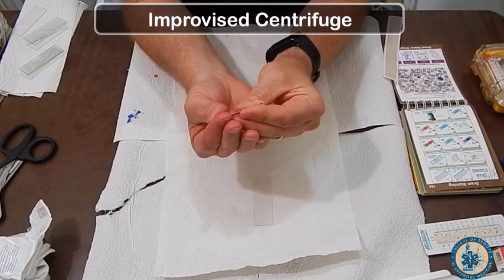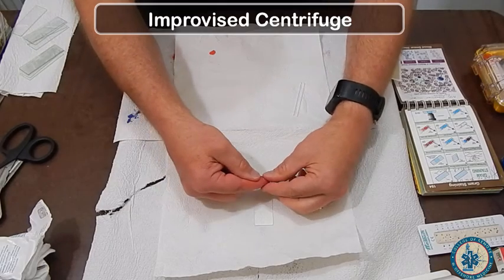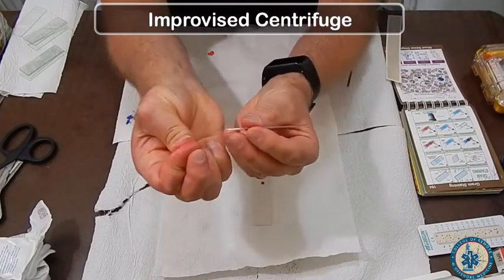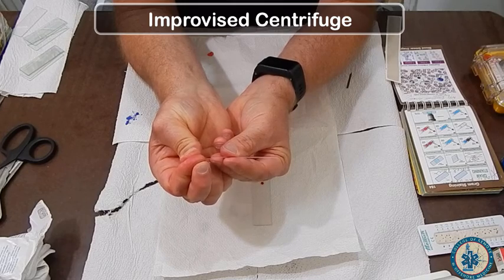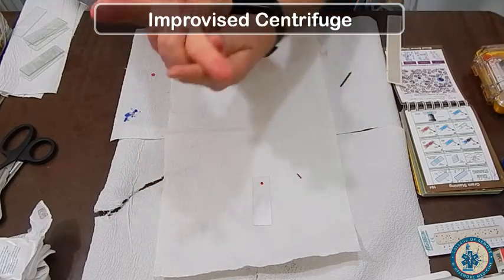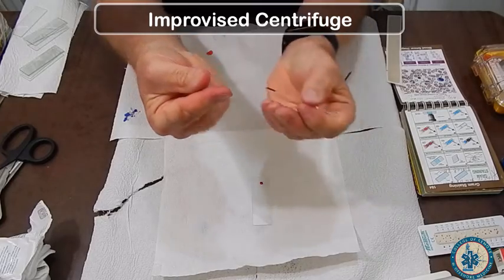First, get a lancet and stick your finger to get some blood. You have to milk it and get it out. You can put it on a slide if you're going to do a peripheral blood smear, but today we're going to talk about the heparinized capillary tubes. Notice how the tube is below the level of the blood coming out of the finger — it is much easier to use gravity when you do this.